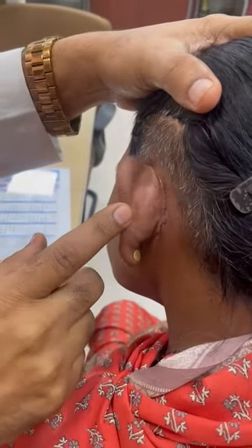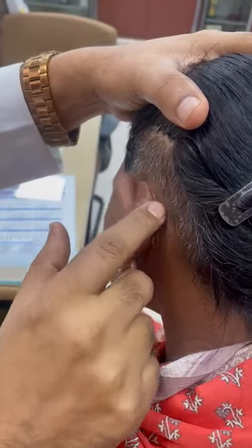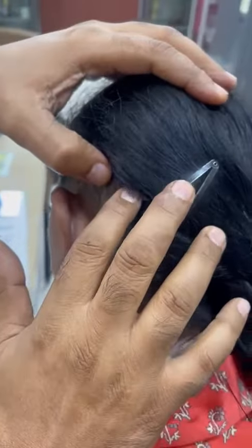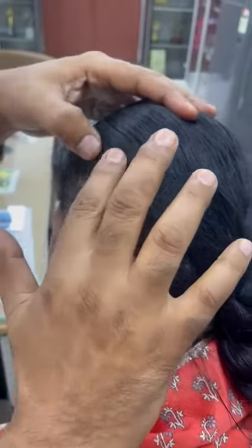You see, this is the postoperative wound. Ana, she was operated from here. We have an X-ray. Can you show me the X-ray of this patient?